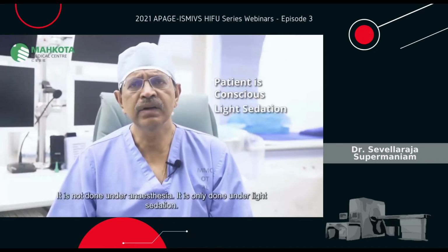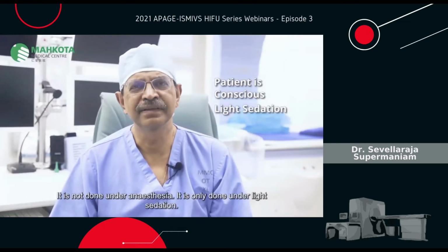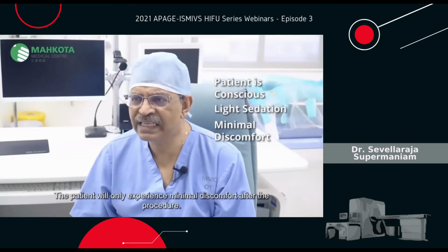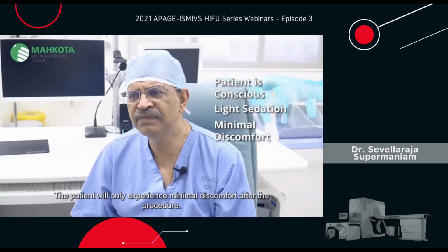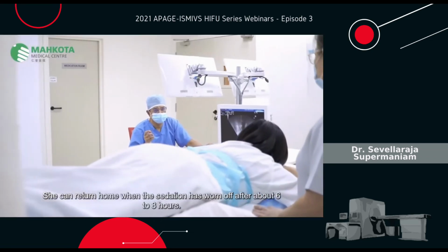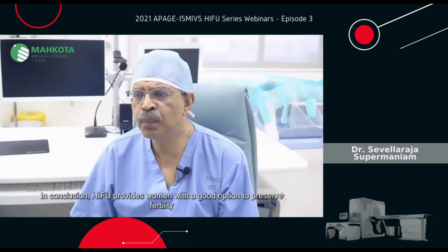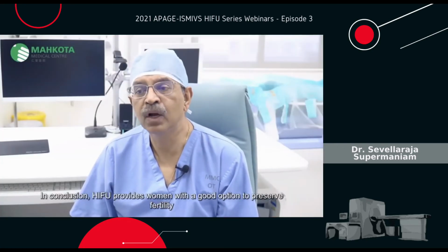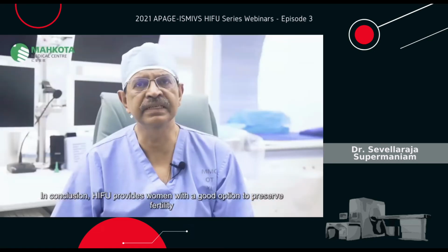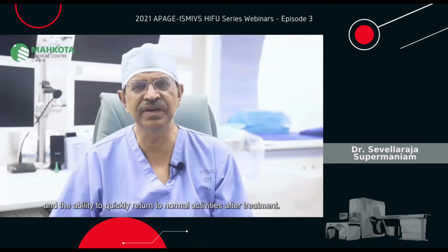It is not done under anesthesia. It is only done under light sedation. The patient will only experience minimal discomfort after the procedure. She can return home when the sedation is worn off after about 6 to 8 hours. In conclusion, HIFU provides women with a good option to preserve fertility and the ability to quickly return to normal activities after treatment.